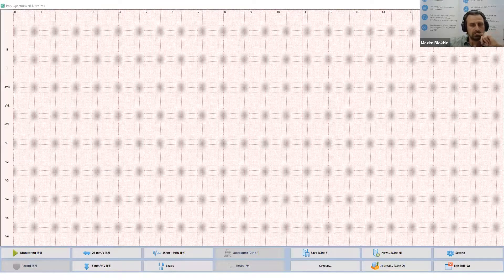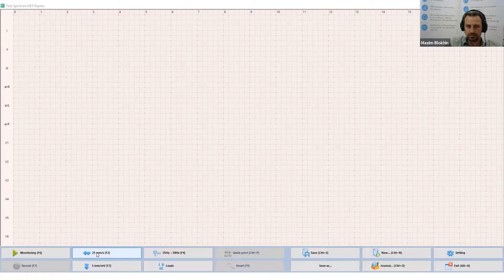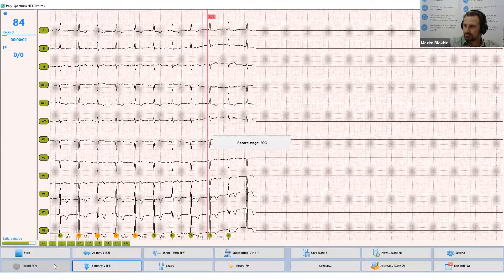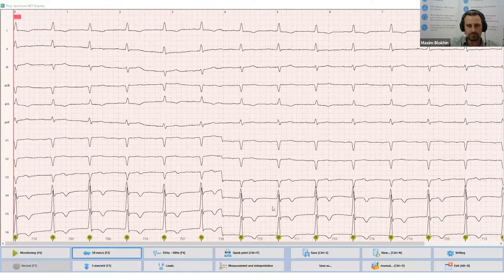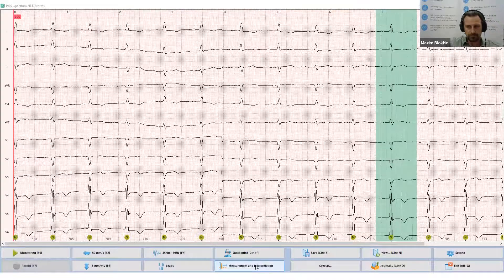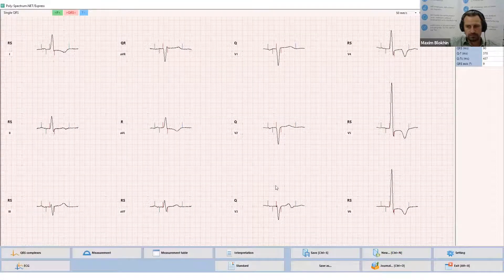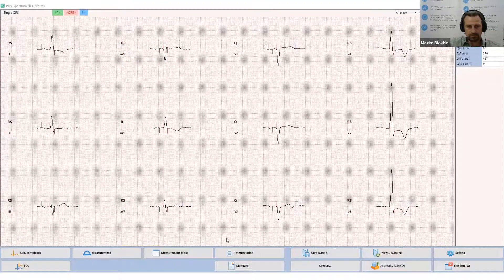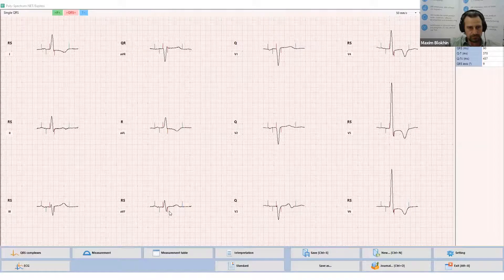Now I will show you a short video about Polyspectrum Express. Polyspectrum Express software allows you to perform an ECG study in a few minutes. Click the monitoring button and check the signal quality, then click the record button and wait a few seconds. Select a QRS complex for measurement — just click the desired part of the record and the software will highlight it. Click the measurement button and all 12 leads of the selected QRS complex will appear on the screen. Polyspectrum Express has already automatically determined all reference points and measured the related parameters.